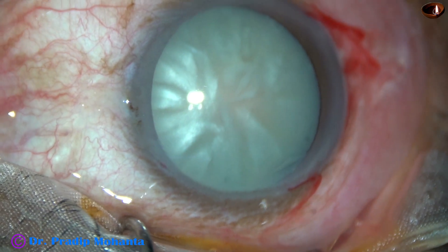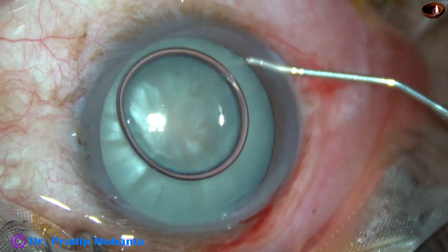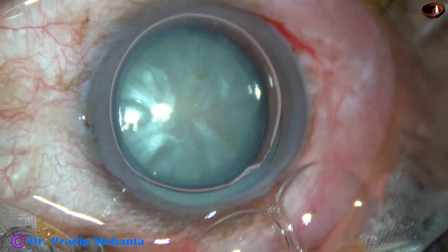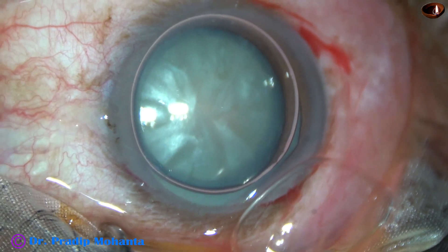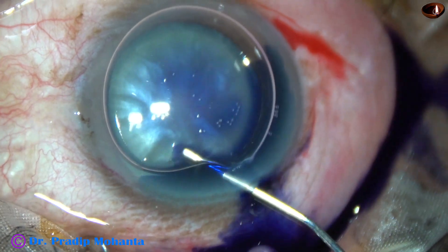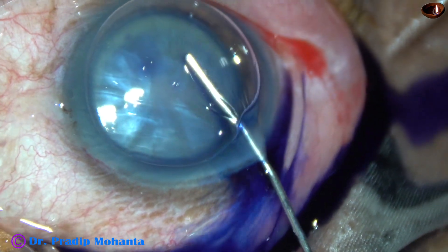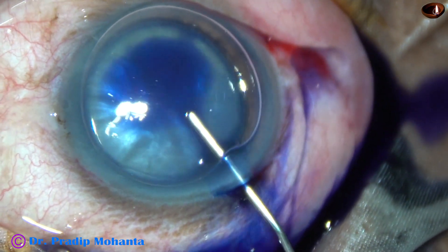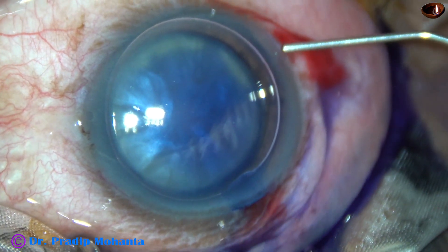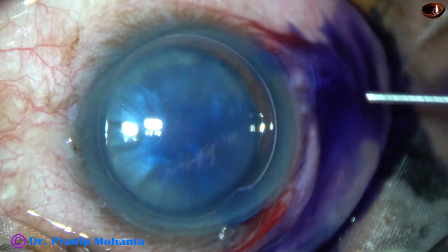And now, an air bubble is injected into the anterior chamber. Beneath this air bubble, trypan blue dye is applied over the anterior capsule. Apply the dye very slowly, and take care that the dye should touch all parts of the capsule. In this case, the capsule in the lower part was not stained.